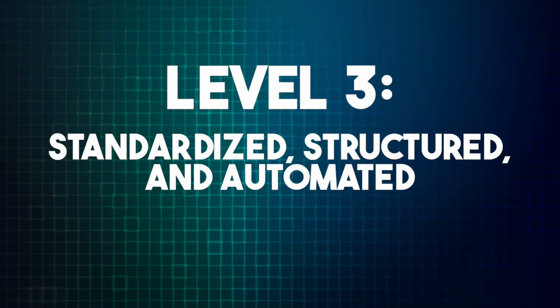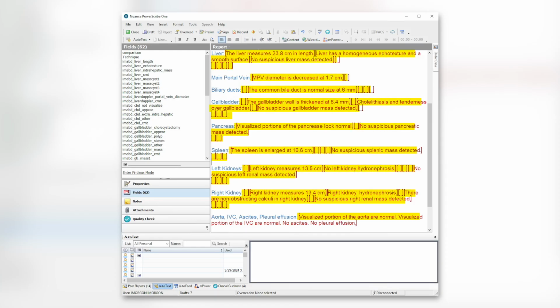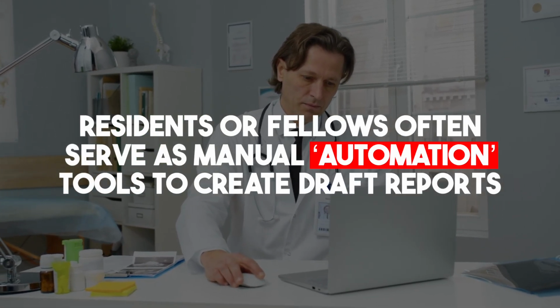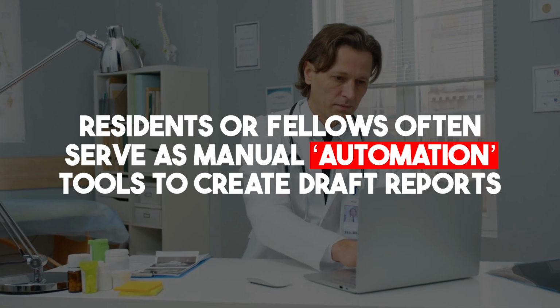Level 3, automation, builds upon the prior 2 standardized templates and structured content to pre-fill all of the findings and perhaps some of the impressions to create a draft report for the radiologist. Automation is in addition to any macros or pick lists you had in level 2.